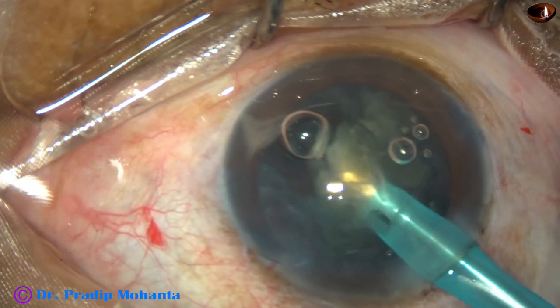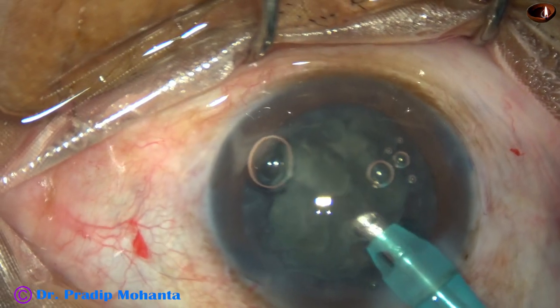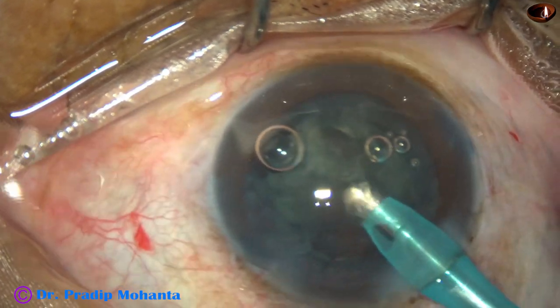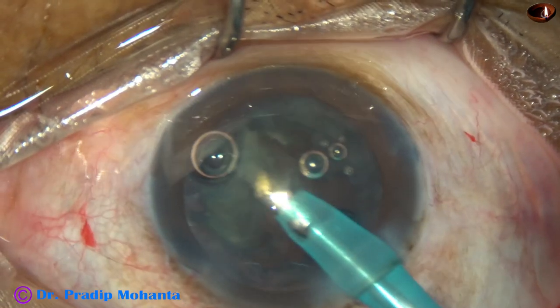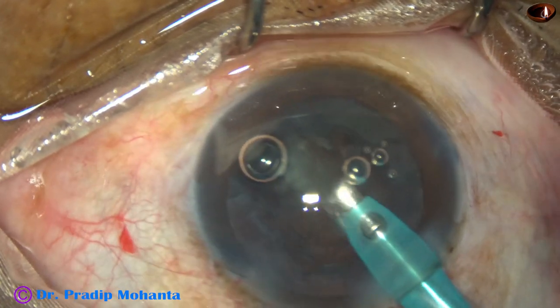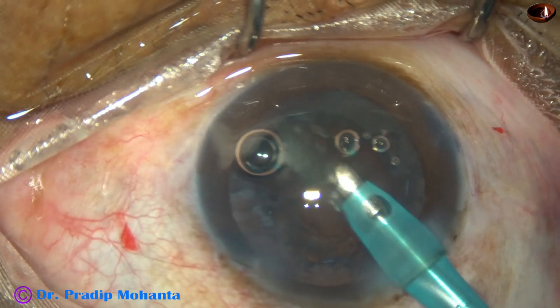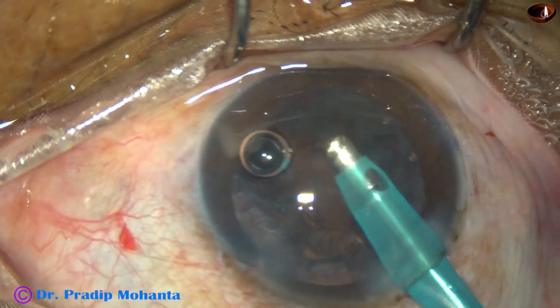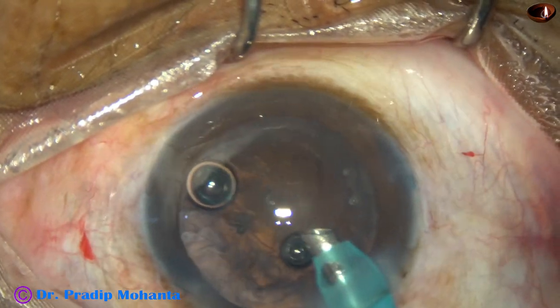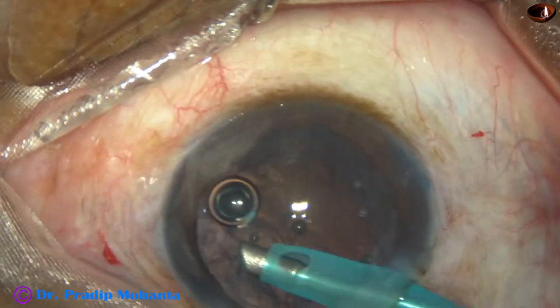I emulsify these two pieces. At this time the flow rate is 30, vacuum is 300, and bottle height is about 60 centimetres. I find that followability is very less, so I increase the flow rate to about 35 and remove these pieces. There is no vitreous in the anterior chamber at this moment. Now I try to mobilize the epinuclear shell.